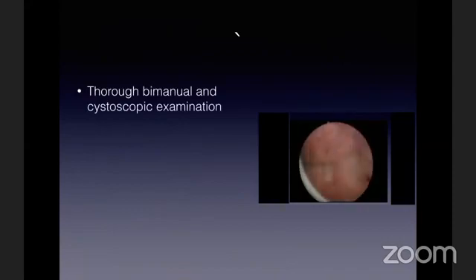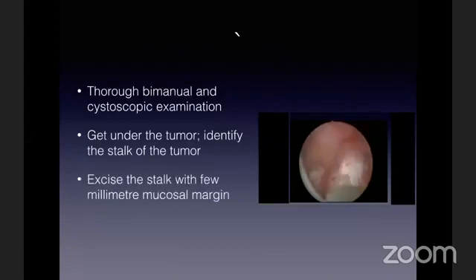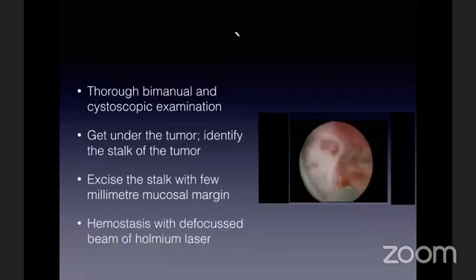This is an elderly gentleman with a 2.5 to 3 centimeter tumor above and lateral to the left ureteric orifice. This is a favorable site because I can get under the tumor and see the stalk very well. I take the resectoscope down, go under the tumor, and identify the stalk. The stalk is not very thick, so I mark an incision around a couple of millimeters away from it. I cut through the stalk and can see the bladder beyond. Any bleeders can be coagulated by a defocused beam. I use the laser at around 30 to 40 Hz and 1.2 to 1.5 joules energy.